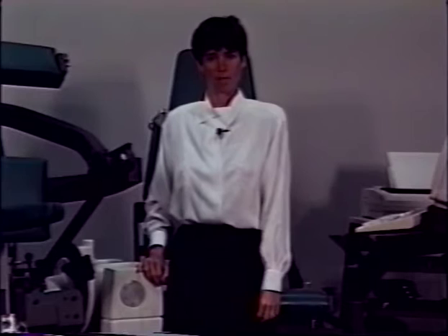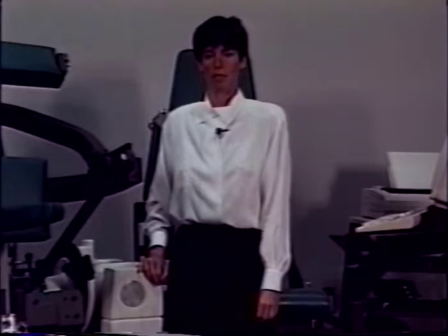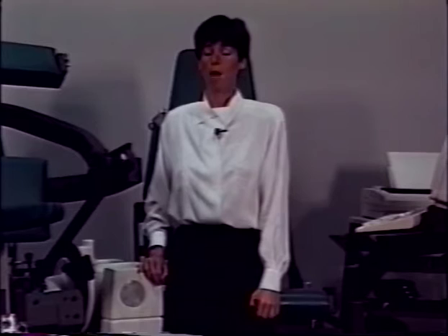Cybex recommends that you verify the calibration of the TEF modular component on a monthly basis. Detailed instructions for calibration and verification are in the Cybex software. These can be found under System Utilities, under TEF modular component calibration.